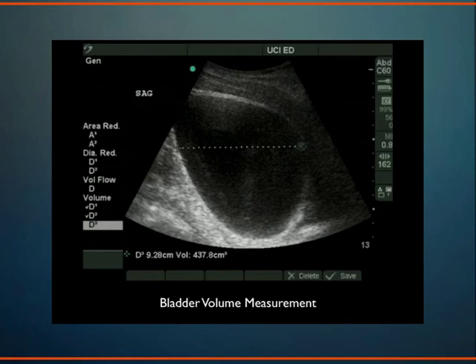So on transabdominal bladder ultrasound, we can measure the dimensions of the prostate. Measuring the prostate and having that post-void residual is useful in many different locations, whether you're in the outpatient clinic, the ER, or the ICU. Those are all good information to have about your patient. Does that answer your question?